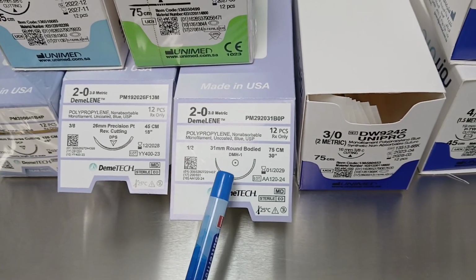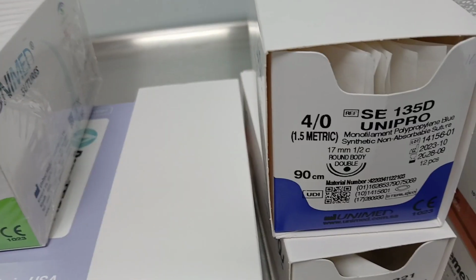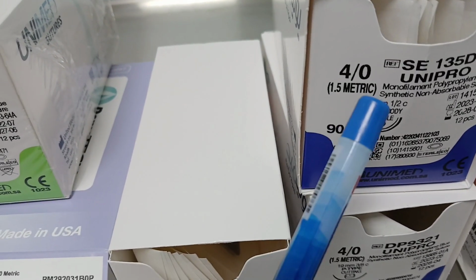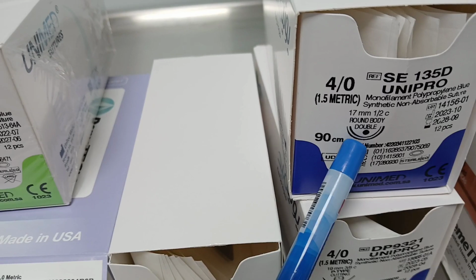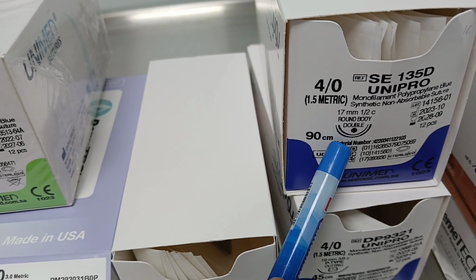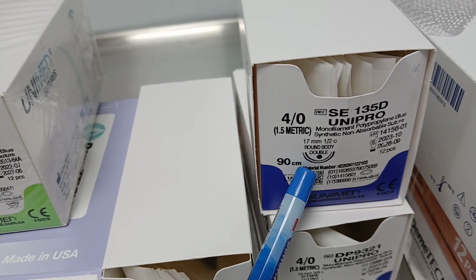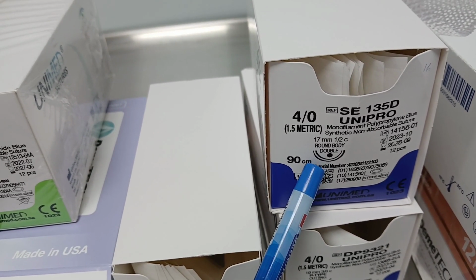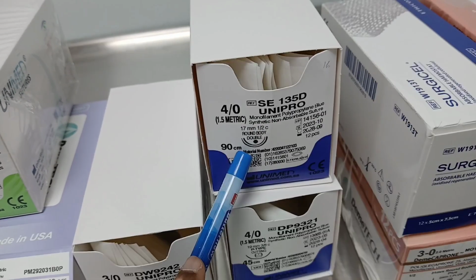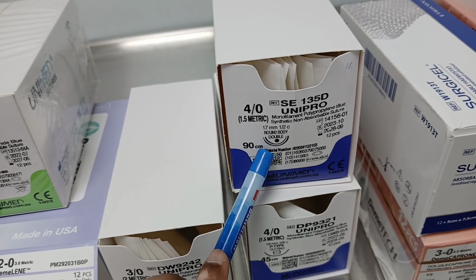Then we have to see single needle or double needle. See here, it is a single needle. This one is a double needle. Here they mention round body double. That also we have to see clearly. Double needle means the suture has a needle at both ends. This type of needle is very small. Mainly we use it for cardiac surgery or minor vascular surgeries. That time we use the double needle. That also we have to observe clearly, whether it is single needle or double needle.